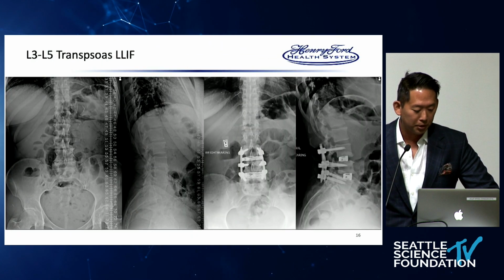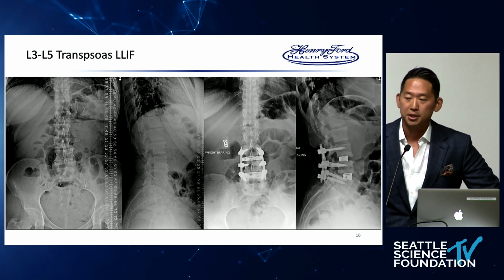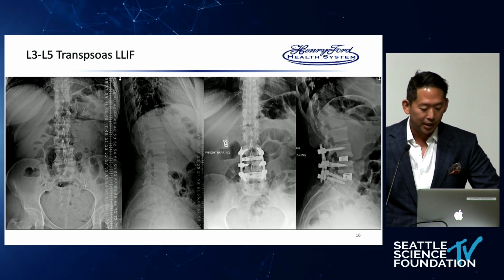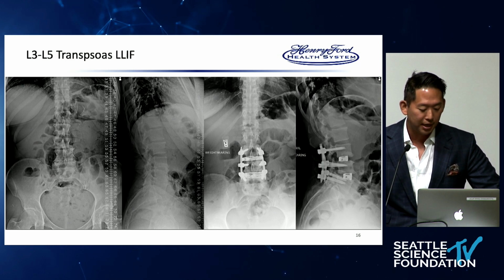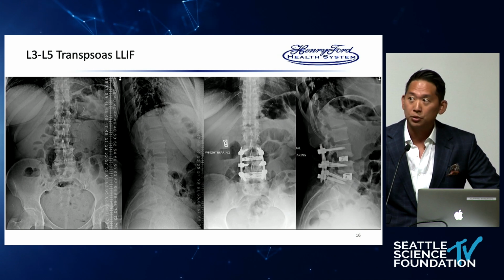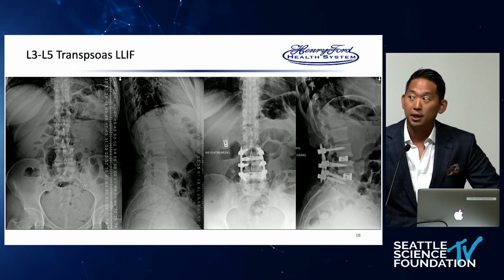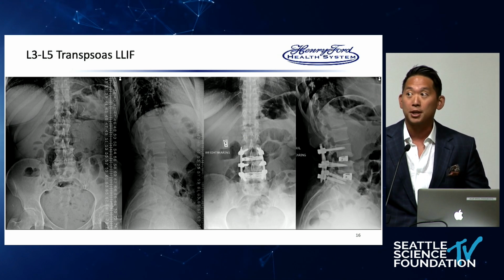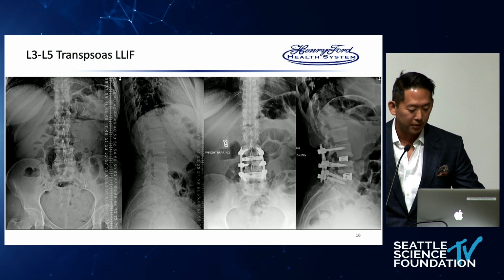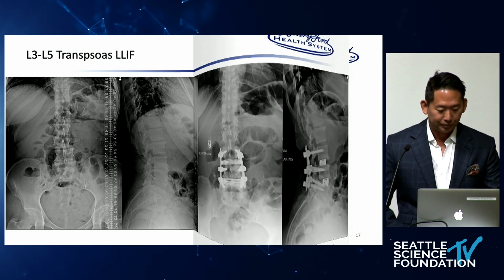So here's another real-world example. This was a lady, a paramedic, who had multiple disc surgeries, multiple discectomies. She had recurrent radicular symptoms just from foraminal disc collapse. So we did a 2-level lateral with posterior fixation. You can see the type of reconstruction you can get with restoring disc height. If you notice on the pre-op film, she's got a little bit of a fractional curve that's developing as well. That's corrected, as seen in the post-op AP.